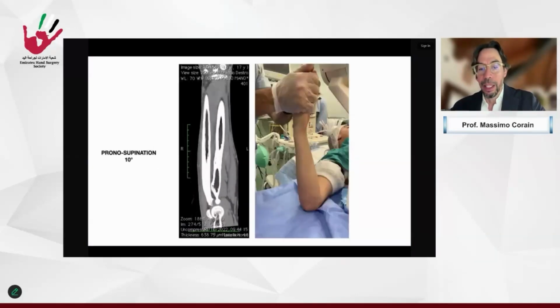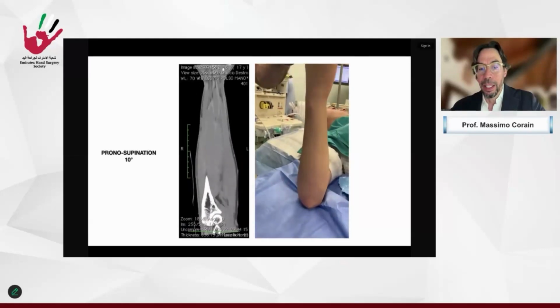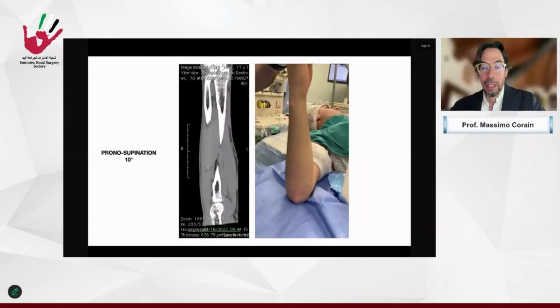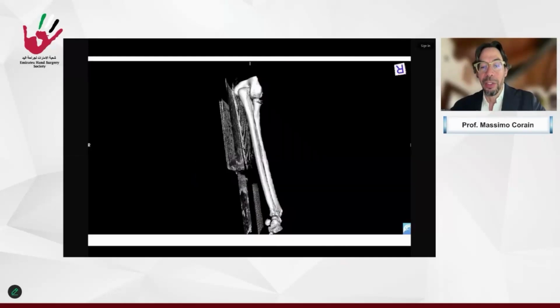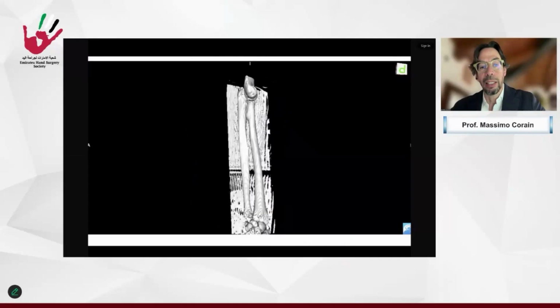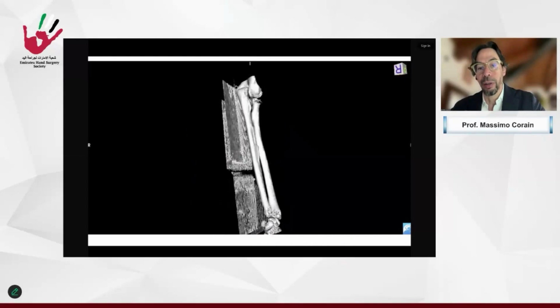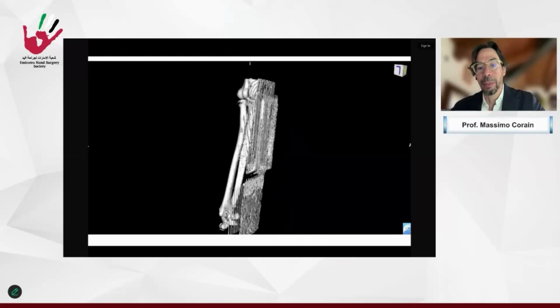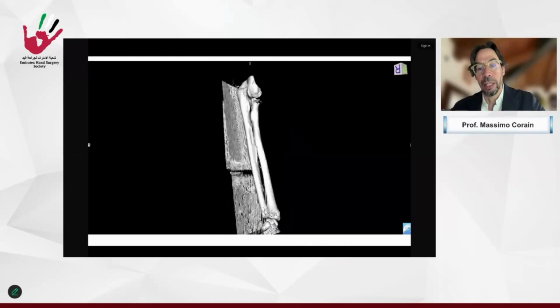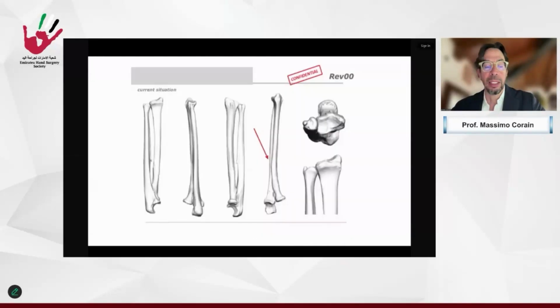This is the CT and the pronosupination lack of the patient with a good disturb in the movement. But without a digital evaluation, it's difficult to see exactly where is the deformity, how to perform it, and how to fix it with the plate, because here we have the insertion of the biceps, we have a neurovascular position that could make it much more demanding. So with the digital planning, we can understand in a better way. So we ask for a patient-specific implant and evaluation.